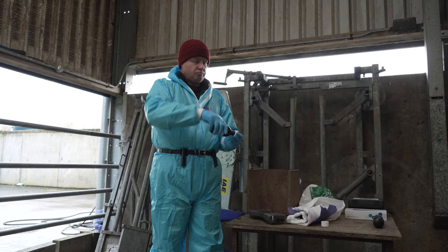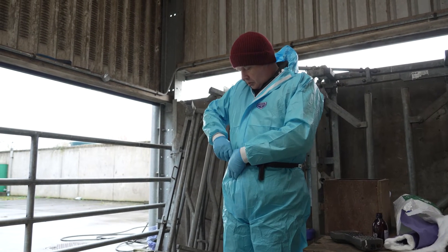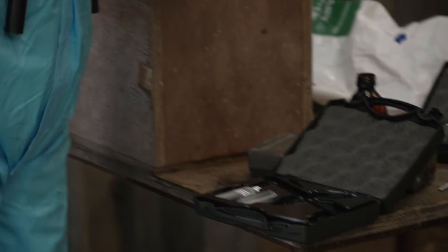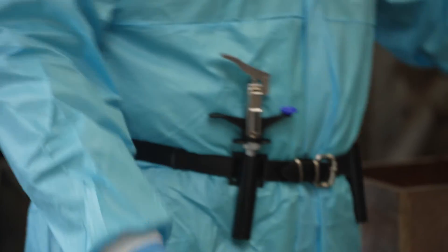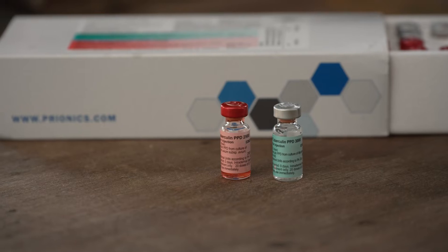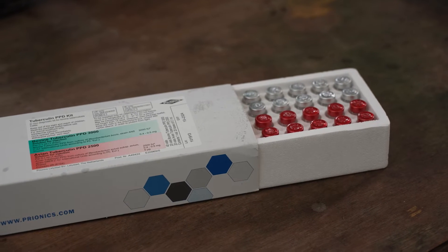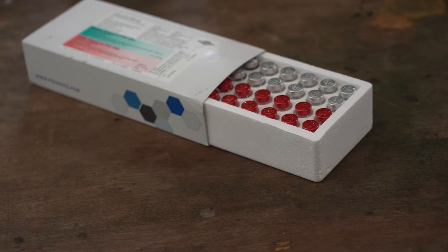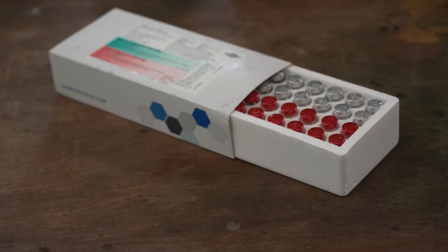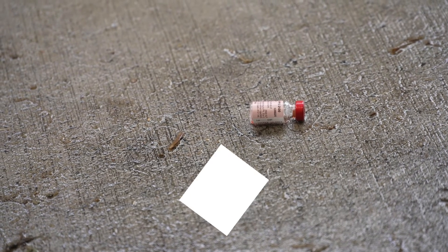A fresh plug of cotton wool soaked in methylated or surgical spirits must be placed in each syringe holster at commencement of the tuberculin test in each herd, such that the needle of the syringe will make contact with it and rest in the spirits between each injection. Tuberculin must only be used on the day the vial is opened. For biosecurity reasons, a vial partially used in one herd should not be used in another herd — the testing veterinary practitioner should commence testing in each herd with an empty syringe and new vials. Used or partially used vials should not be discarded on farms.